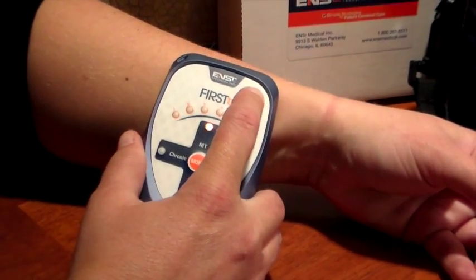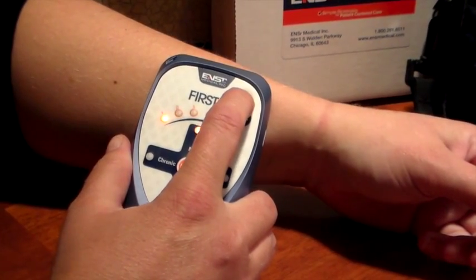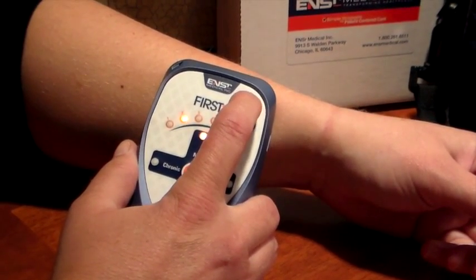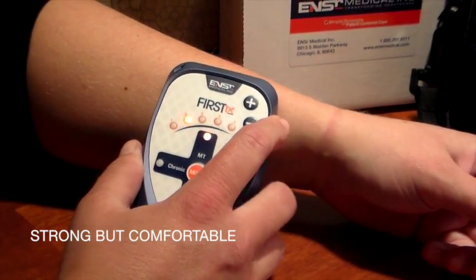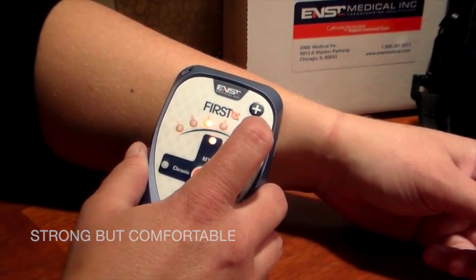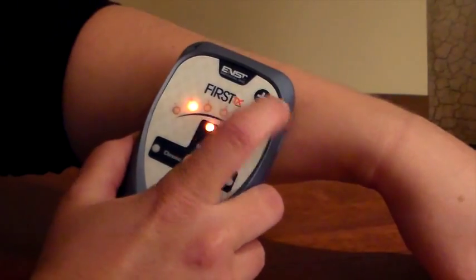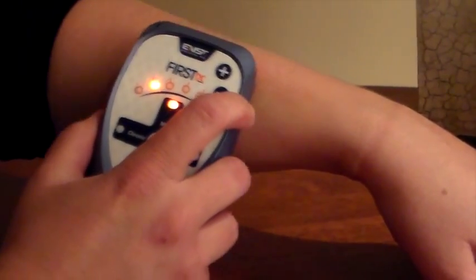Go ahead and press the plus and minus buttons to set the intensity and energy level. The client should feel a tingling sensation, and you want that sensation to be strong but comfortable. You do not want to go to the point of pain. So use the plus and minuses to set that comfortable level. Now you've set the intensity or energy level that is comfortable for the individual.